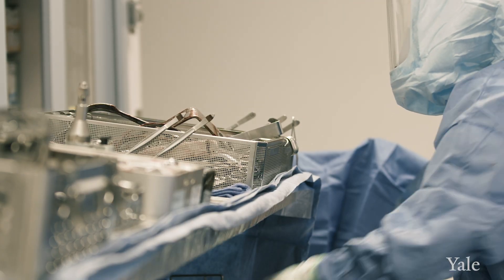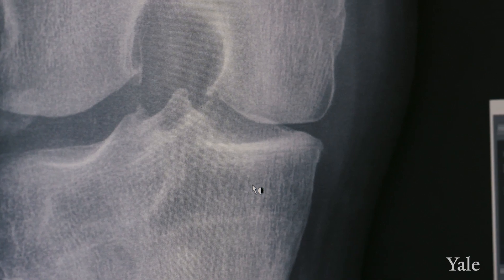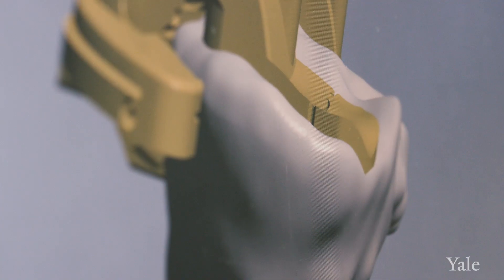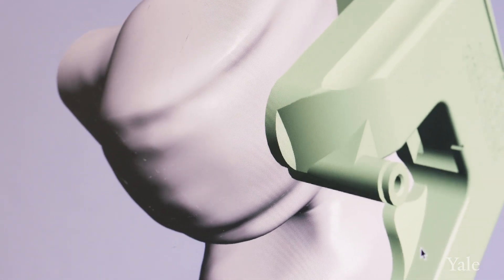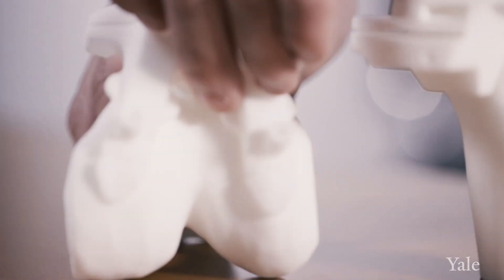Total joint replacement is when we replace the surfaces where the cartilage has been broken down or worn out, and we replace it with metal, plastic, or ceramic surfaces.